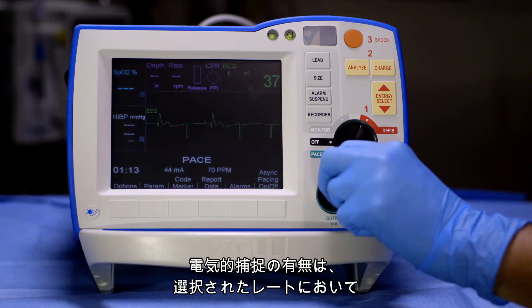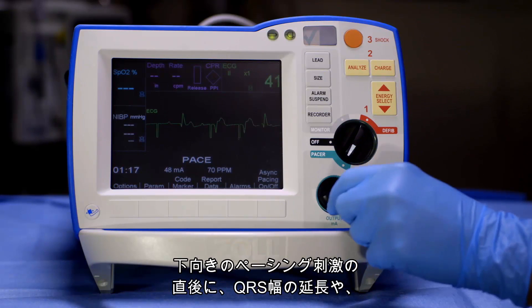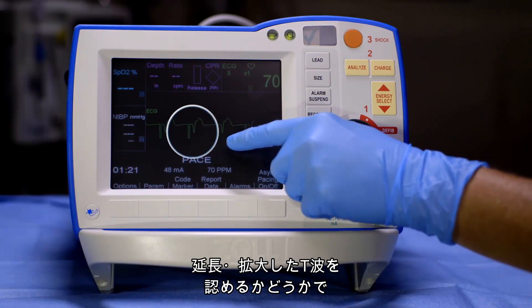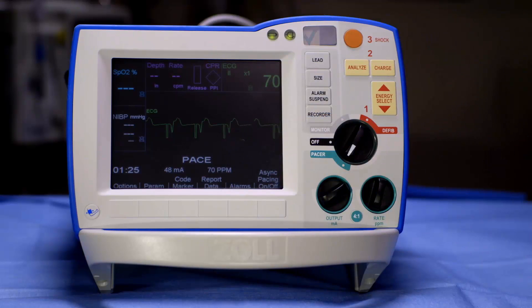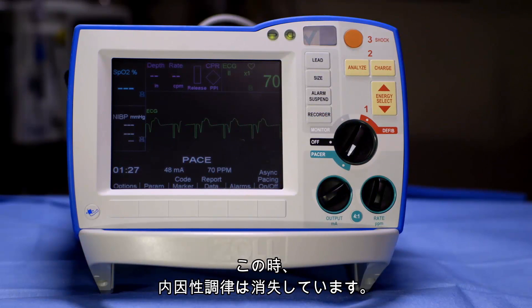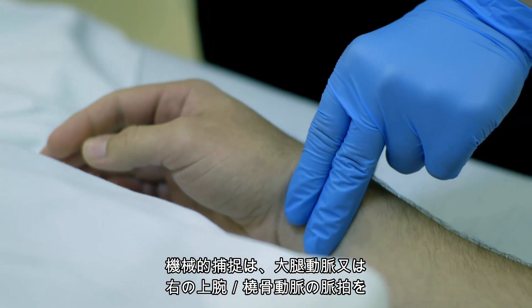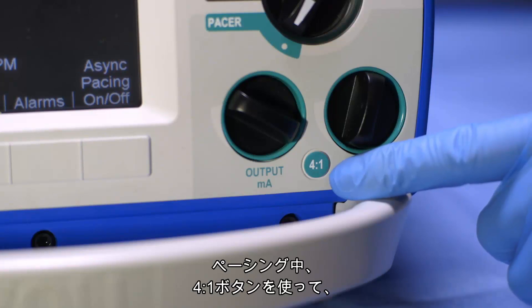Confirm electrical capture by viewing a downward pacing spike followed immediately by a widened QRS and an extended, sometimes enlarged, T wave occurring at the selected pacing rate. The intrinsic rhythm should be absent. Mechanical capture can be confirmed by physically palpating a femoral or radial brachial pulse.